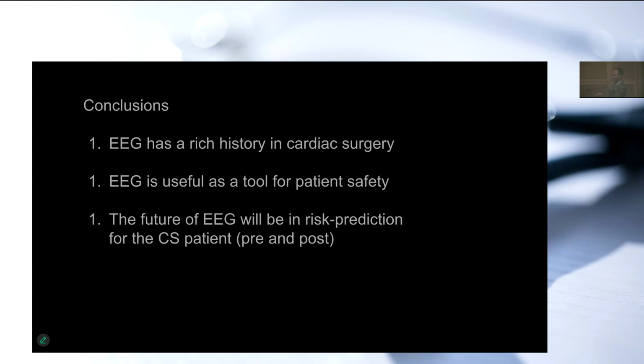then their EEG on bypass, for example. There's all these stages where you can make inferences about what the EEG should look like, but it's only based on your understanding of what it should look like that you can target something. And that's a problem, right? Because that comes down to sort of knowledge, and that knowledge, as you can see, is evolving quickly. So there will always be a fundamental limitation because the EEG is an epiphenomenon.